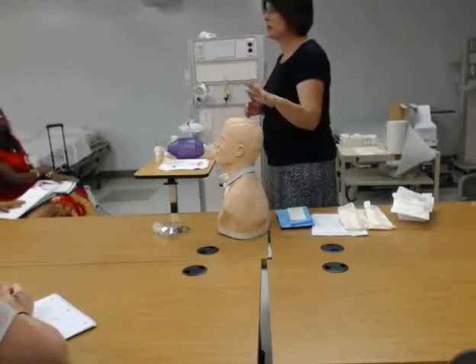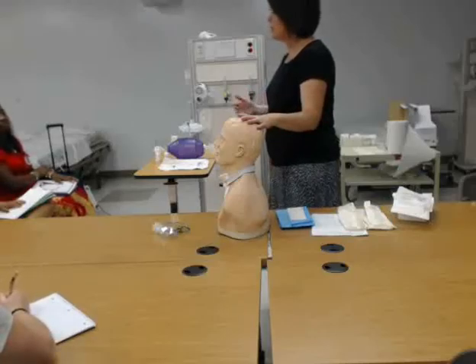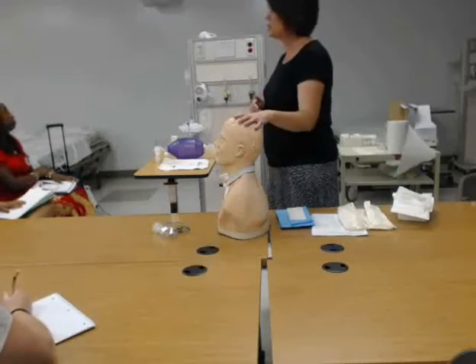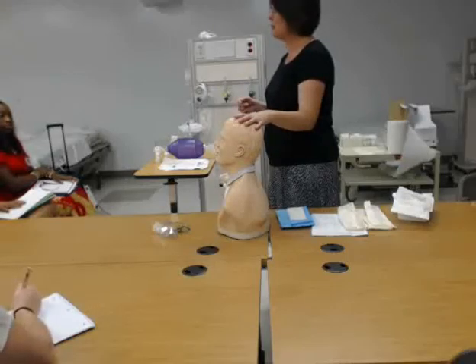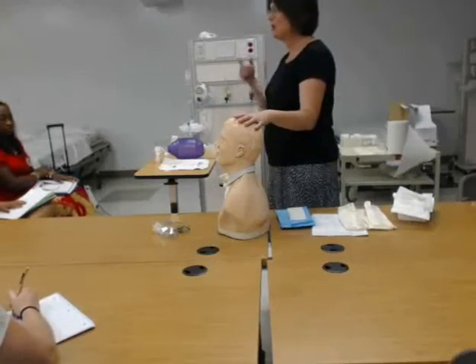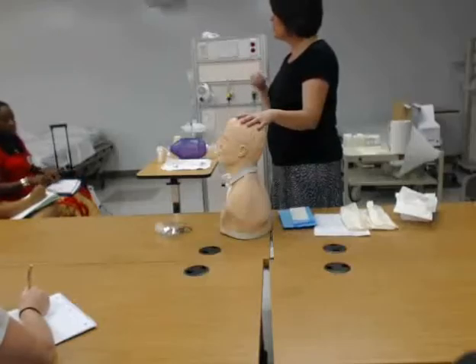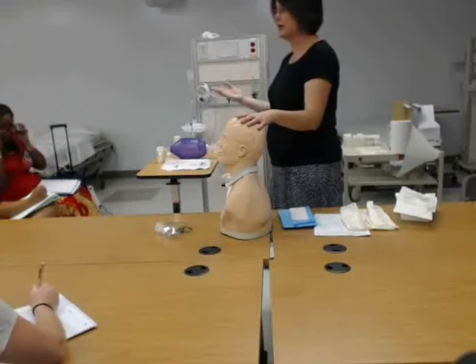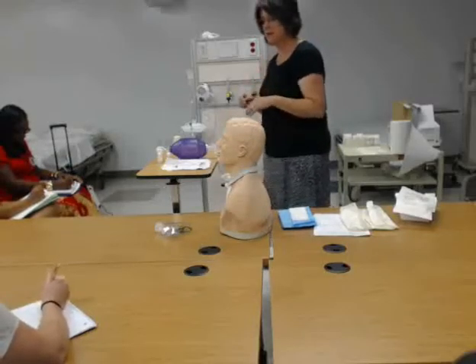What we're going to do now is I'm going to show you about sterile suctioning. What you'll have to demo on Monday is sterile trach suctioning. But the same technique can be used for nasopharyngeal, oropharyngeal, orotracheal. You always want to be sterile — have a sterile catheter and sterile glove on when you're suctioning a patient's airway, because the airway itself is sterile.